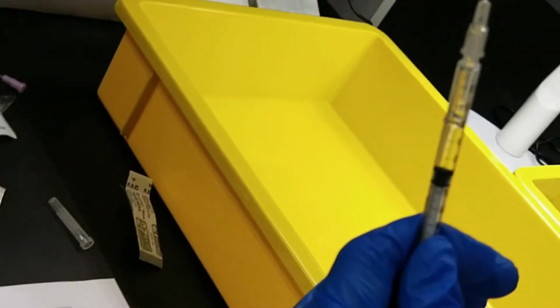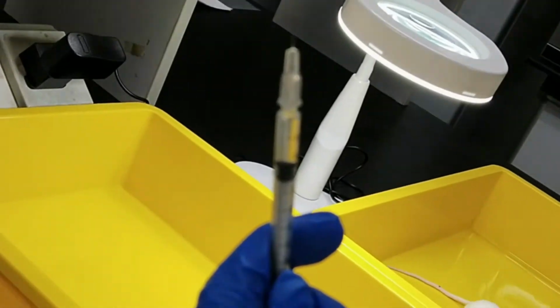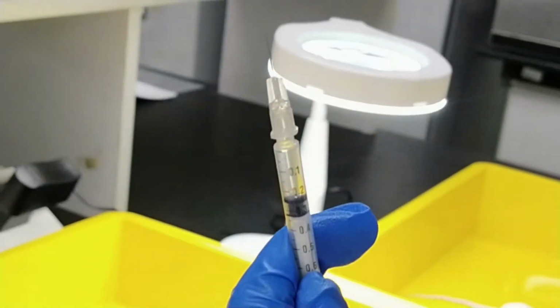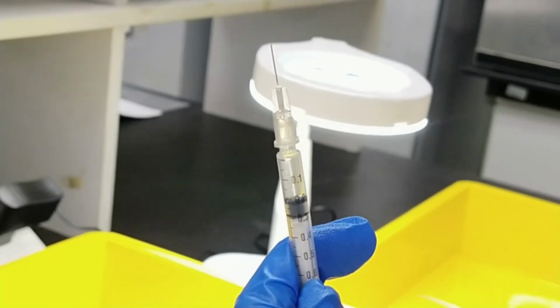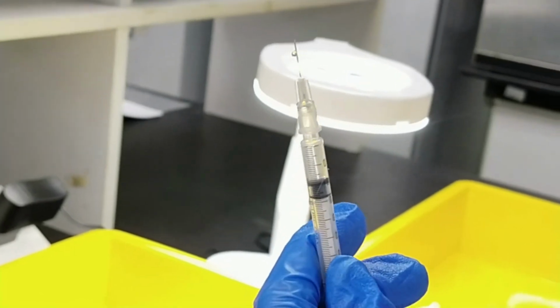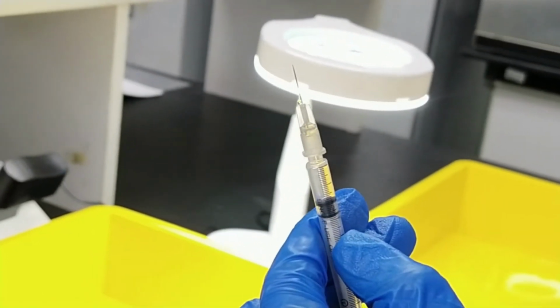And as usual, you also need to fill up the drugs into the needle as well. Make sure that there's no bubble inside the syringe. Okay, then after that we need to adjust the volume up to the desired volume, which is 0.13 ml.